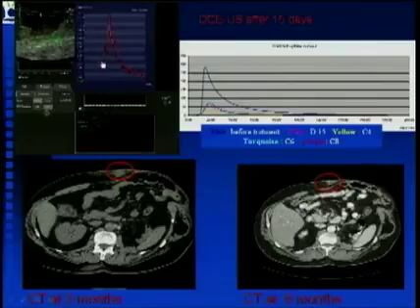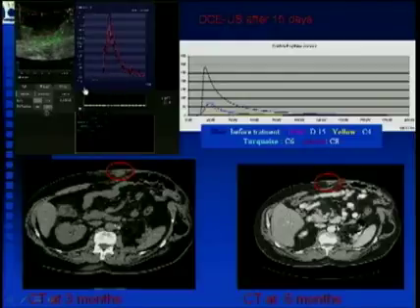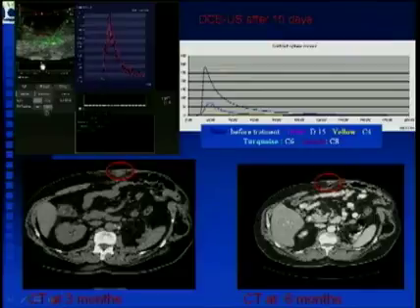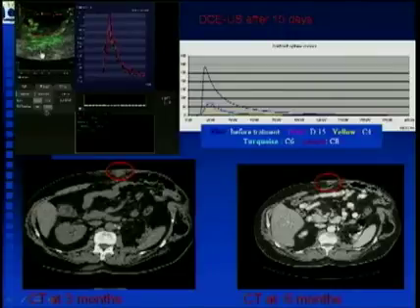So we follow the patient after 2 weeks. Remember, according to the RECIST criteria, we have no modification of the size. But check, if we inject the SonoVue, we have only a very small vascularized area. So it's amazing to demonstrate that only after 2 weeks. And this technique is also very useful currently for the sequential biopsy for the genomic analysis.